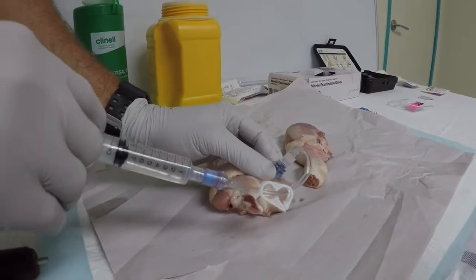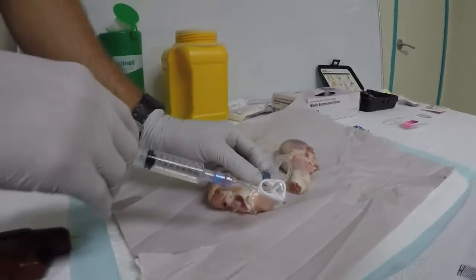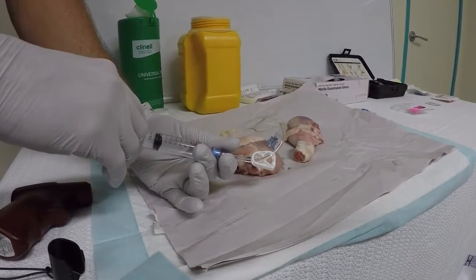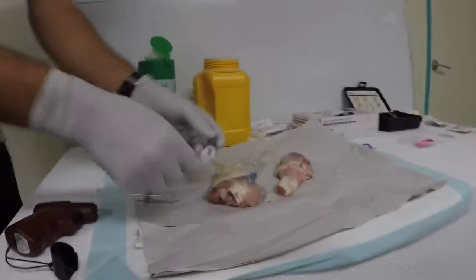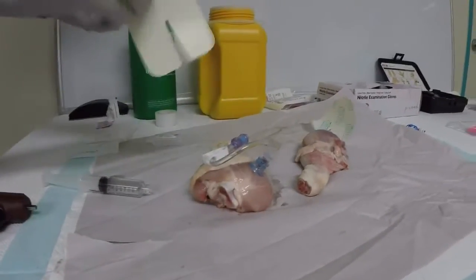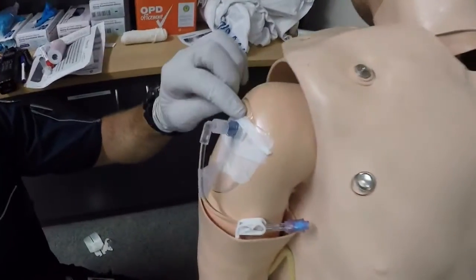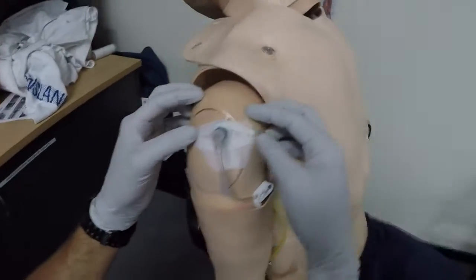It won't be discussed in this video, but in the conscious patient it's appropriate to give some anaesthetic, such as lignocaine, as a flush due to the pain that can be caused by flushing fluids into the medullary cavity, particularly in the tibial insertion. Once we've confirmed patency, we then secure the insertion site with an opsite, just to ensure sterility.